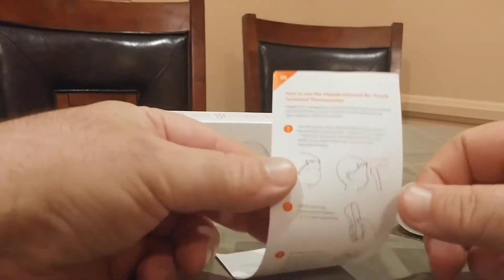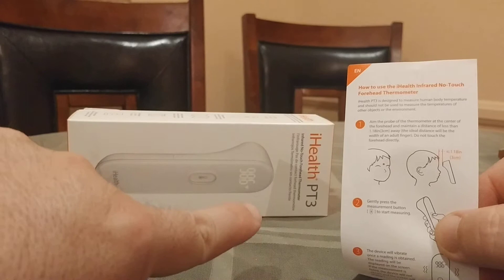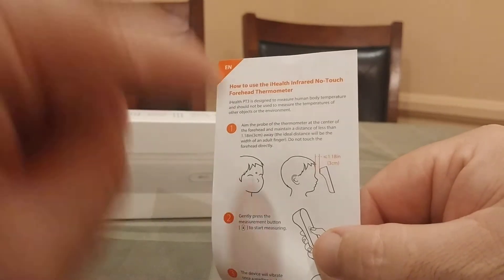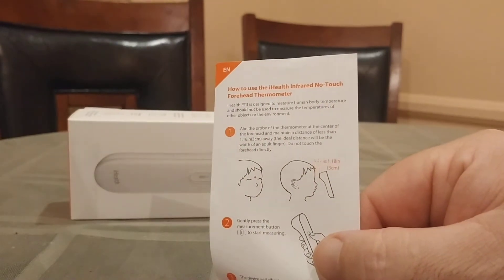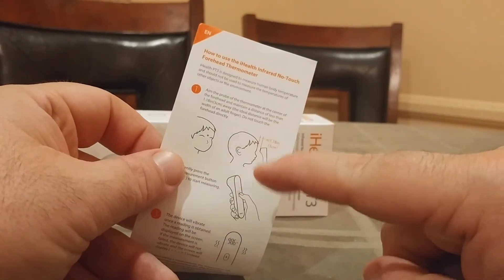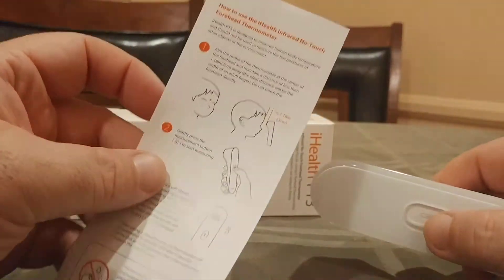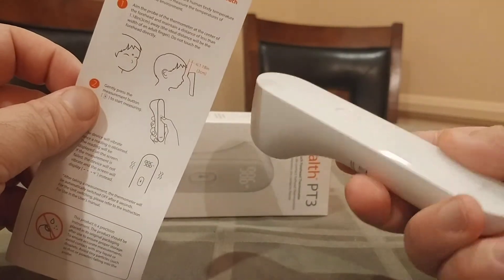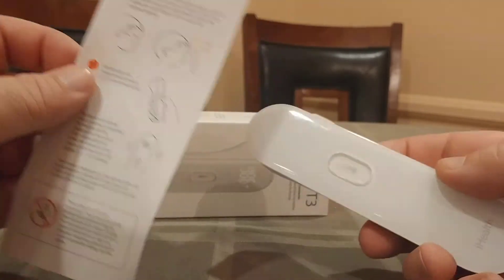So in the previous video, I showed you what the instructions of the iHealth PT3 were. They basically tell you to take a reading about 1.18 inches or three centimeters away from a person's forehead. The problem I had with this is that if that person has been sweating, or wearing a baseball hat, or has long hair, sometimes the reading is inaccurate because the device is actually picking up on the temperature of the sweat, not necessarily the skin temperature.